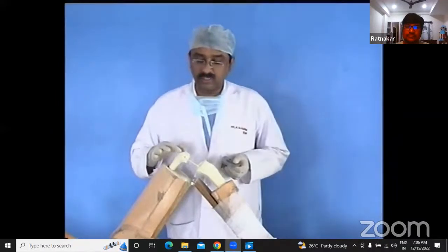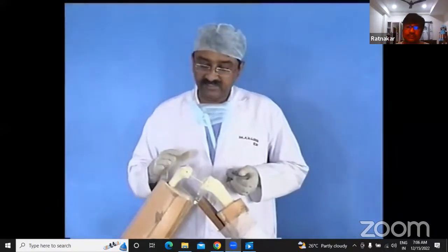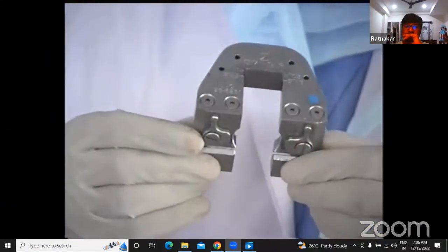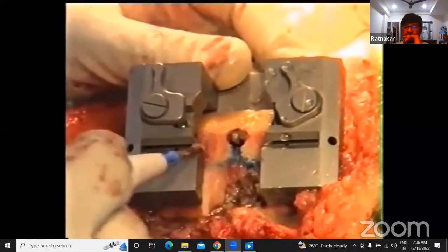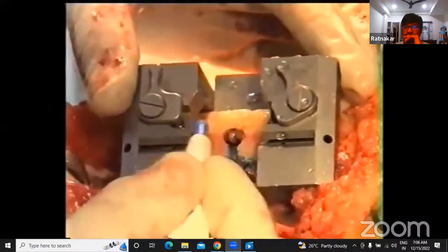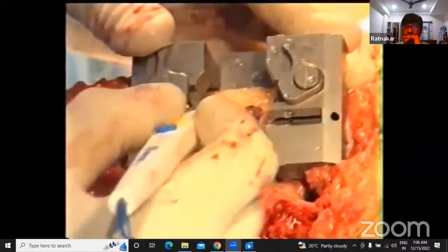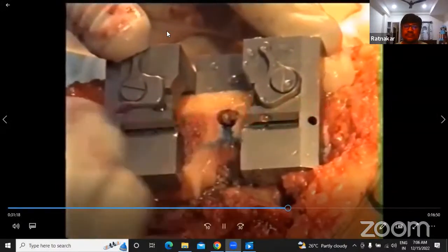Now I'm going to show you how to convert this into a posterior stabilized or cruciate sacrificing femoral cut. For doing a cruciate substituting or posterior stabilizing, you have to use this zig, which will provide you an extra box cut. Now we are going to go for the box cut. And here we should lateralize the implant slightly for better patellar tracking. So I'm just moving it out and making a diagonal cut there so that I can see the box. So the box comes there and there. So that is all right.